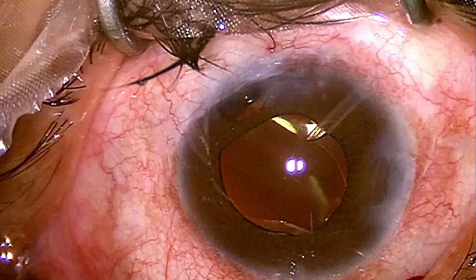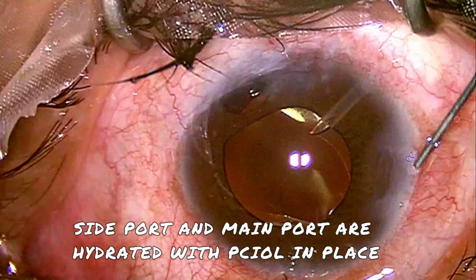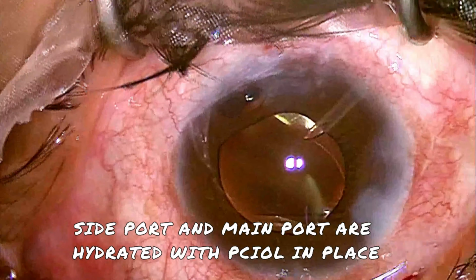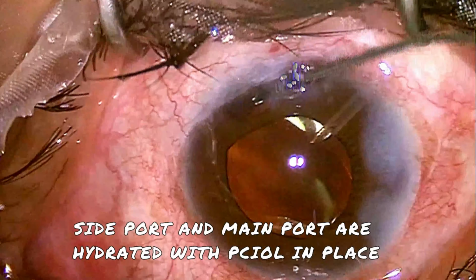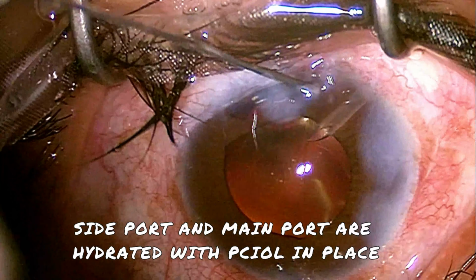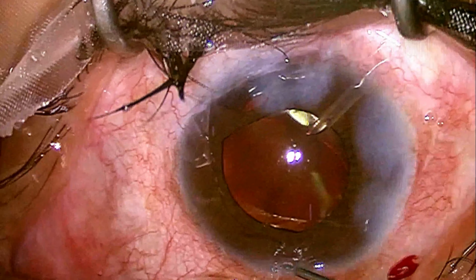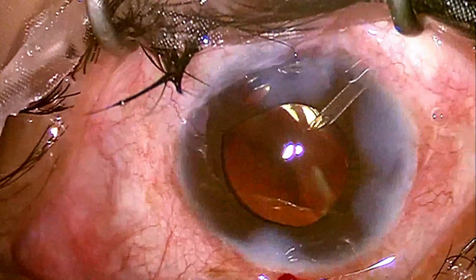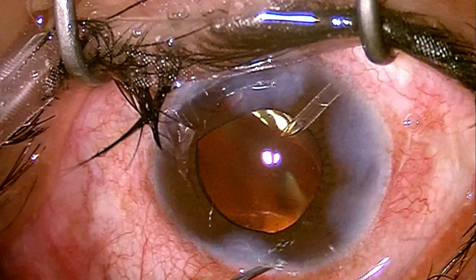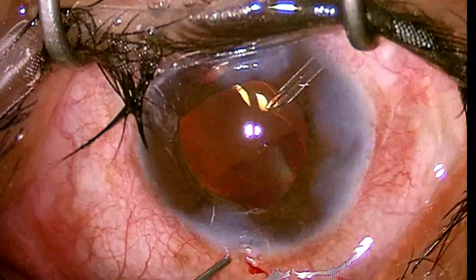Now, as we can clearly see, the lens is well placed in the capsular bag and the anterior chamber is well formed. Now routine closure of the wound by hydration of the side port followed by hydration of the main port is done, and the case is successfully completed. And we can also see that there is no damage to the Ahmed glaucoma valve.